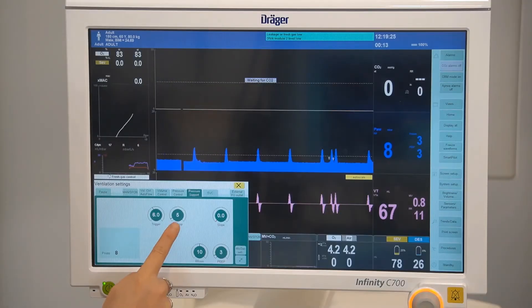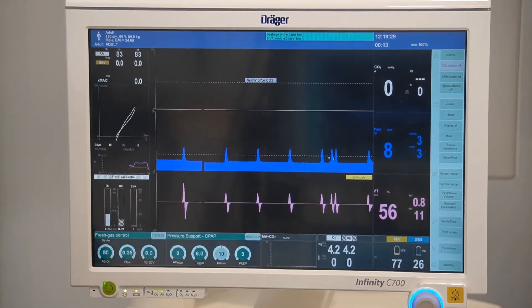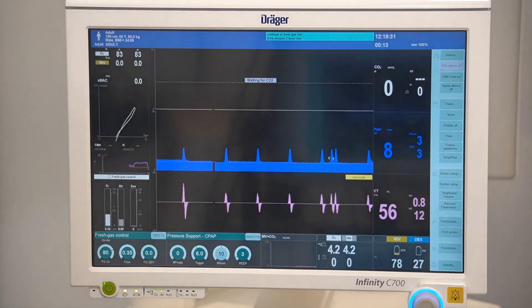Turning delta pressure support off will allow for complete spontaneous breathing.